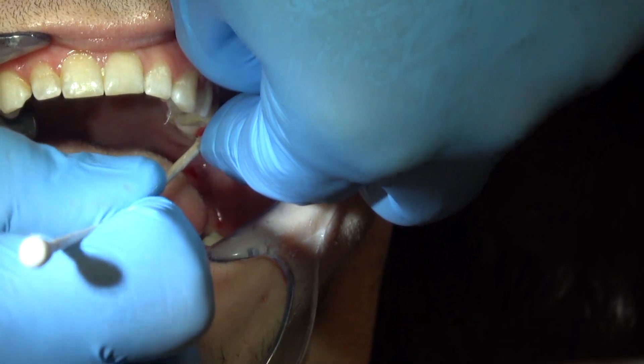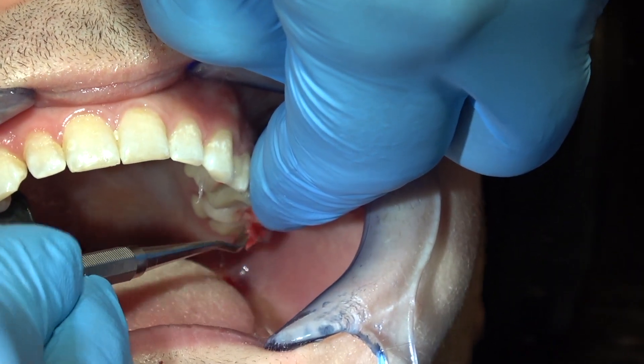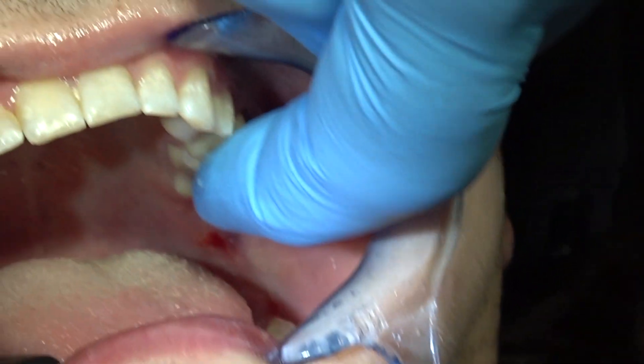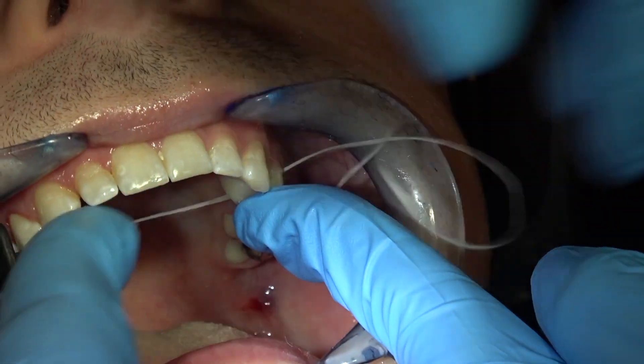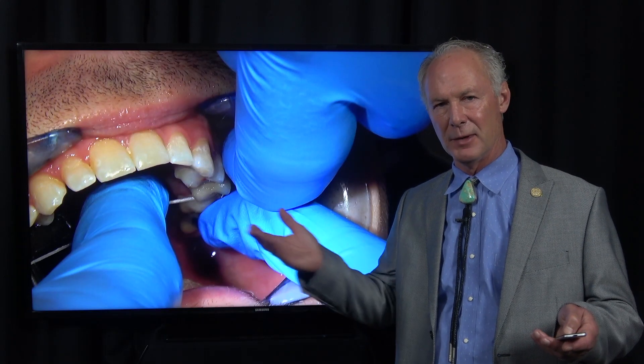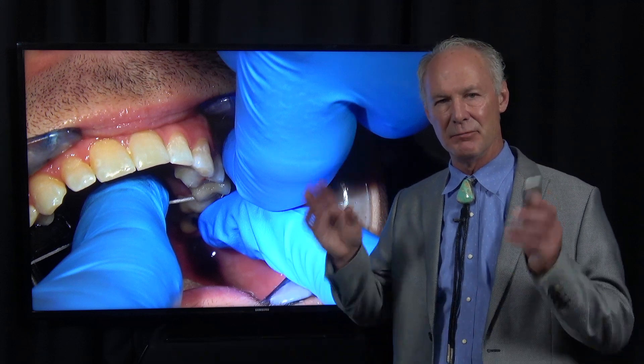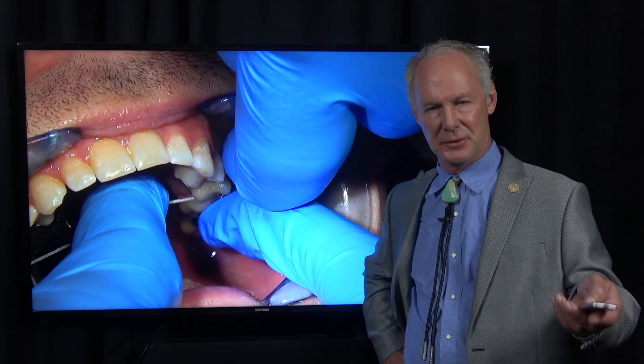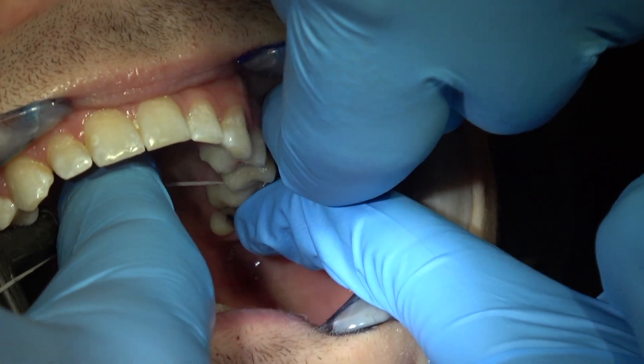It's fun to put in crowns if the occlusion's right and the interproximal contacts are right. If you've seated all these crowns and had to adjust the contacts, you're going to question whether you want to be a dentist or not — it's just a pain to have to go back and adjust them. So use the solid model. And now you know how to control bleeding with that 38% phosphoric acid. Somebody commented once that their professor said that doesn't work — well, just try it. It does not affect the gingival tissue and it's a fabulous hemostatic agent, much better than Hemodent or any of those things, because it causes it to scab.